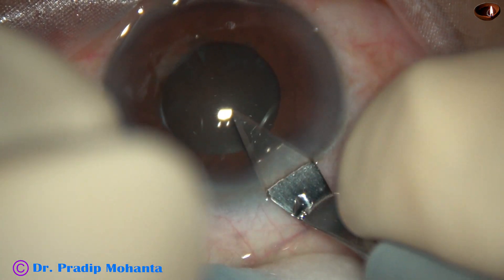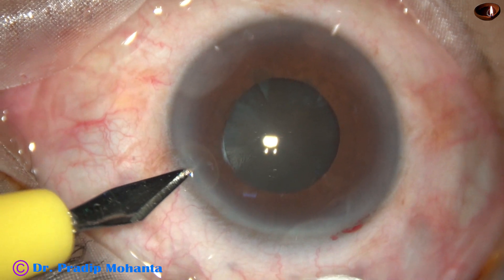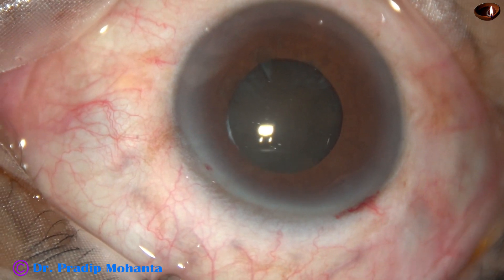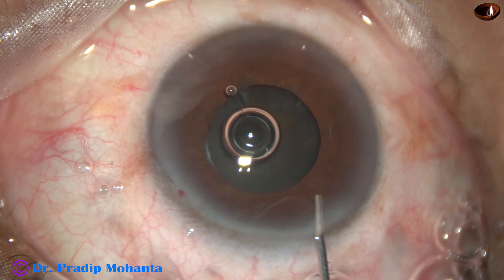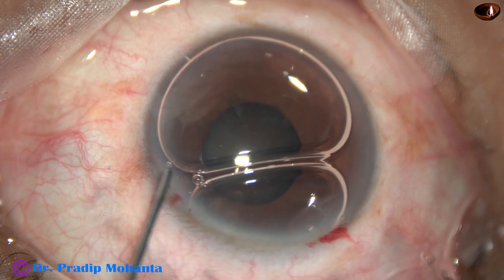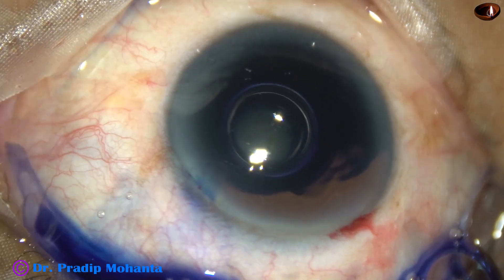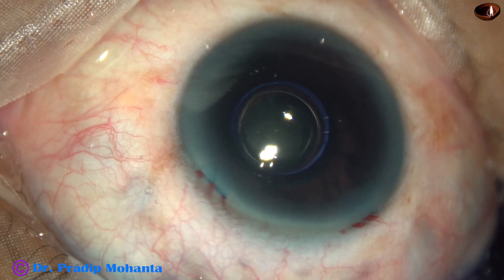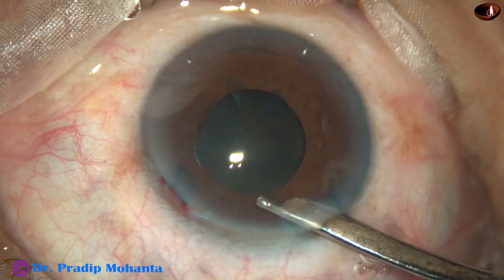Let us observe this surgery from beginning till the end without any edits. The main incision has been made at the posterior aspect of the limbus. I have included some capillaries in the wound so that there is a bit of bleeding. Healing is faster and firmer if we include some capillaries at the wound, and the chance of infection is also less, because the first line of defence is the neutrophils, which can reach the site of infection easily if there are some capillaries.